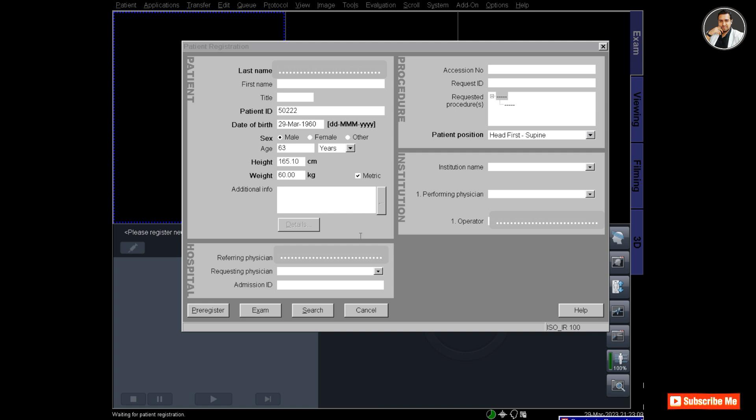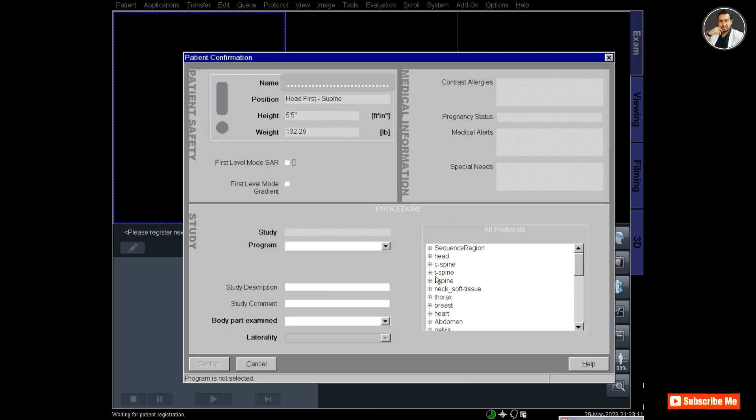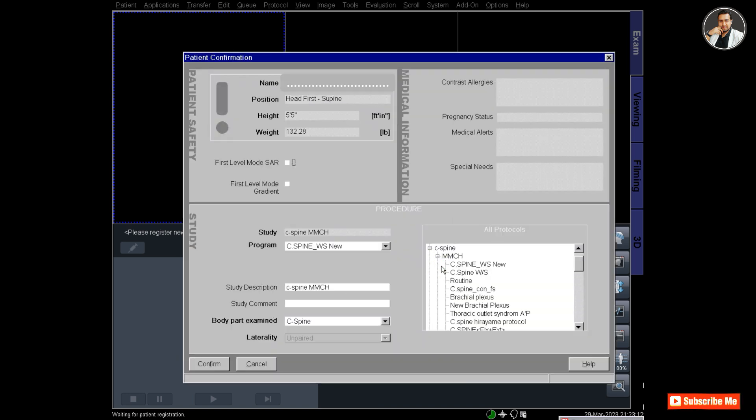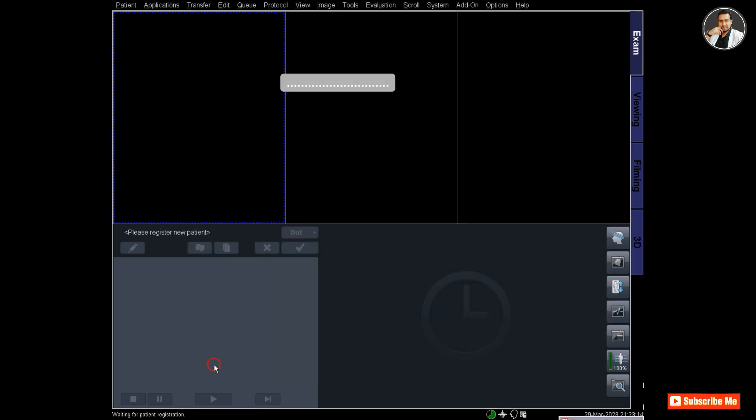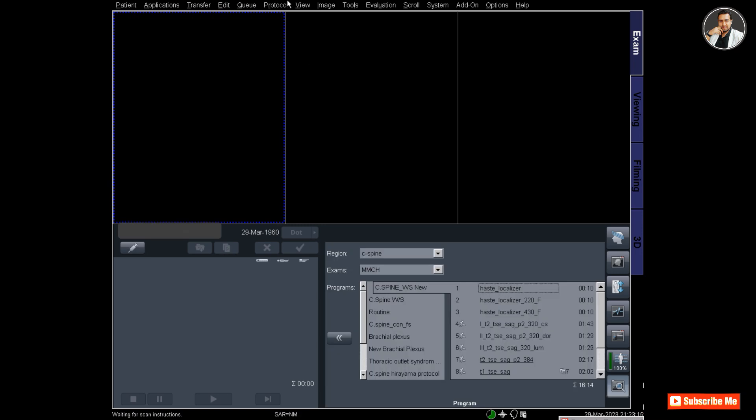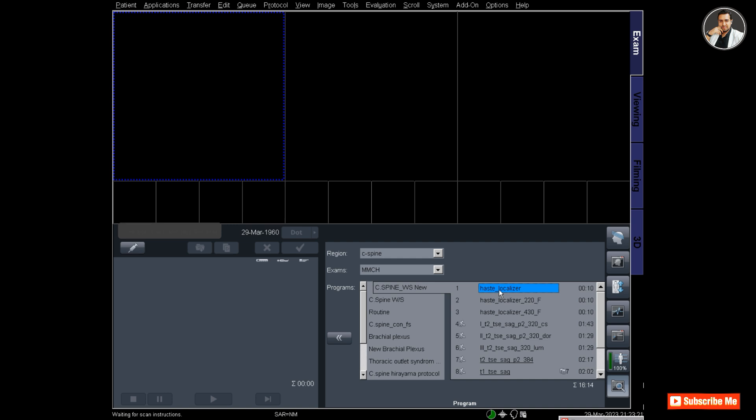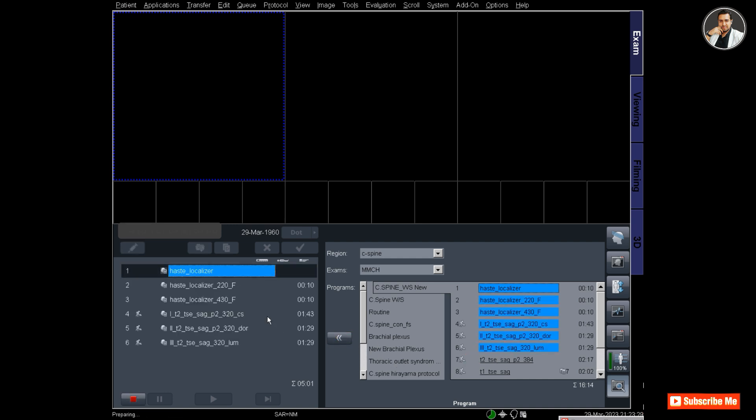Hello radiographers, let's do MRI Whole Spine. For this, first register the patient and then select the Whole Spine protocols. I'm now selecting from the cervical spine Whole Spine folder and I selected six protocols.